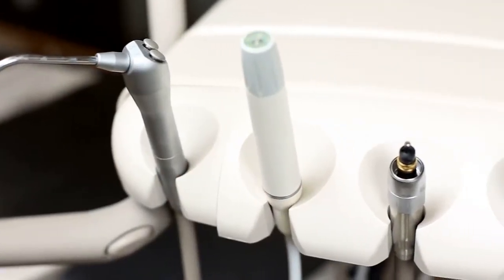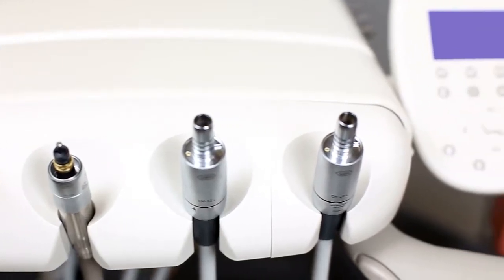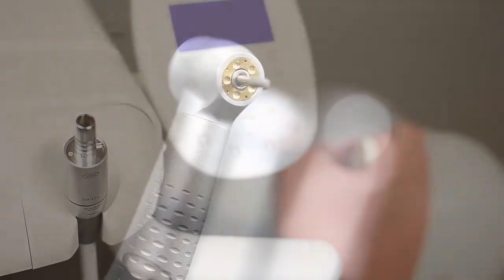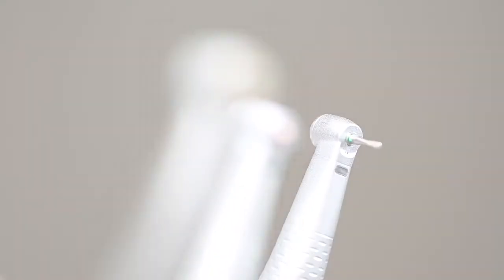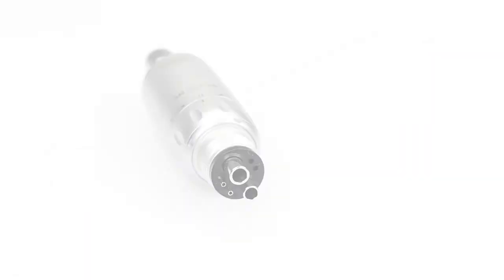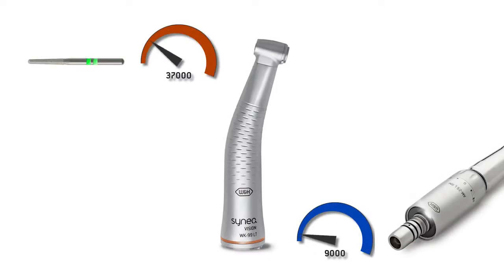Depending on which drive possibilities are available to a dental unit, different possibilities are available to the user for achieving these speeds. At a basic level, we can differentiate between air-driven and electric-driven transmission instruments. Compressed air is used to drive dental turbine handpieces and air motors, which can then power green and blue straight and contra-angle handpieces.